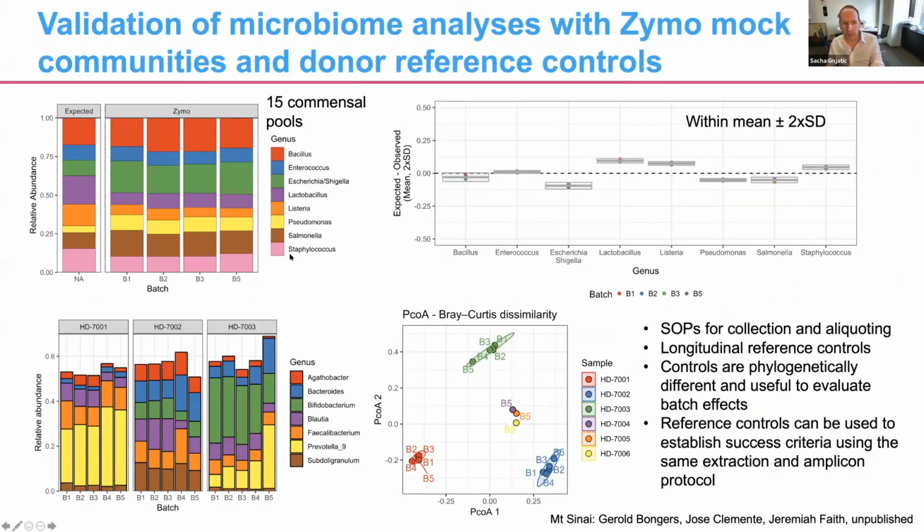And finally, one of the other assays that we're very interested in developing has been the sequencing of the microbiome, because there have been a bunch of papers showing that the gut composition of the microbiome could be very important in supporting immune responses as part of the immune checkpoint treatment.